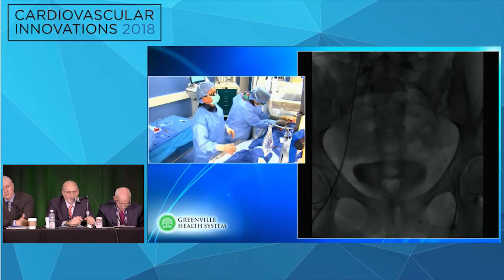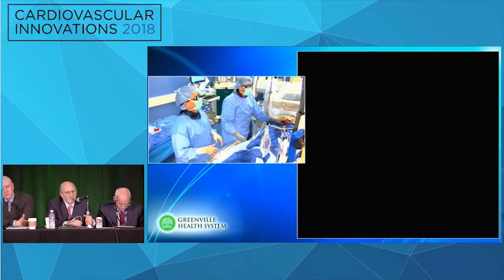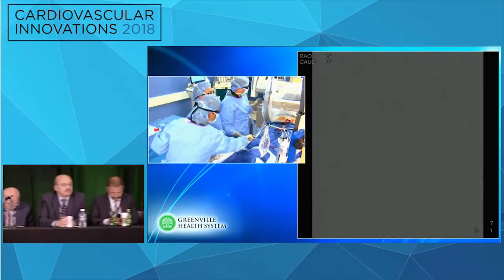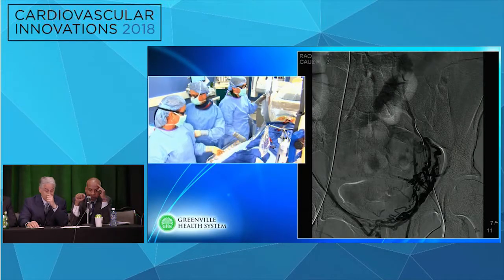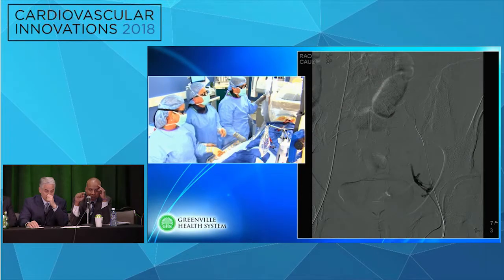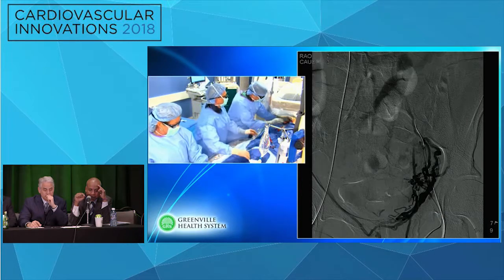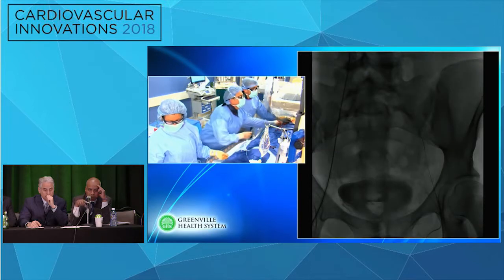But I don't think a SIM2 will work, it's very smooth. You said that you pull it back and forth, it'll just bounce right off. But anyway, here is another comment that I would have made. Perhaps I would have done an MRV before the case. Obviously now is not the time to talk about this, but just as an FYI, getting an MRV before you did the case would have been useful. I think that being on the contralateral side is making your case more complicated than it needs to be. If you had had an MRI or other non-invasive imaging that would have characterized the nature of your lesion or the location, then you would have known from the beginning that doing a below approach in the pop or whatever would have expedited the case and saved you all this trouble.